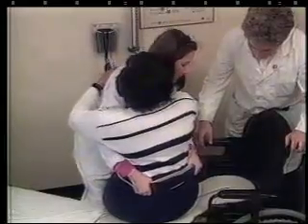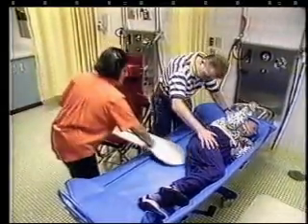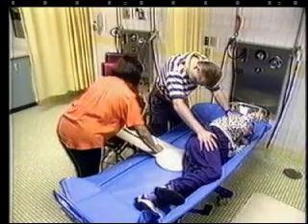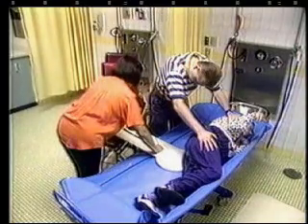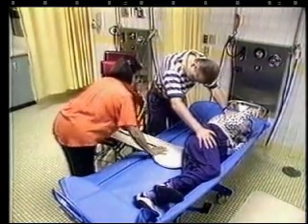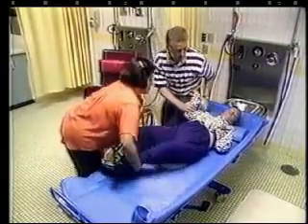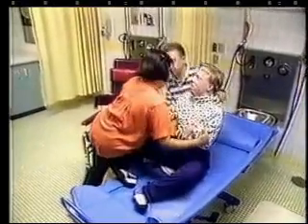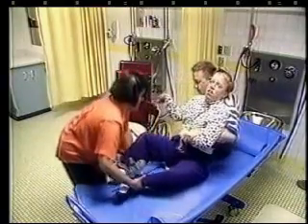A common question is about the direction of the transfer. Place the Beasy on the approximate space vacated by his buttocks or the upper thigh. Roll the patient onto his or her back with their buttocks resting on the seat. Assist the patient to a seated position and proceed with the transfer.